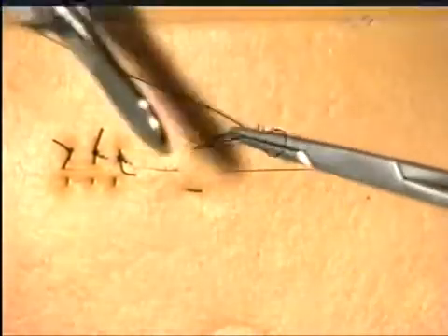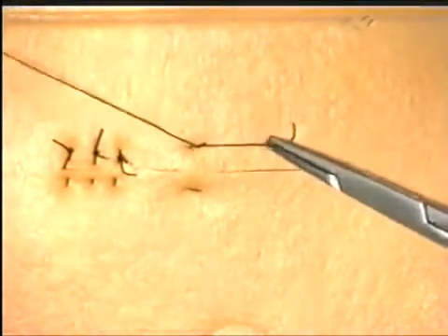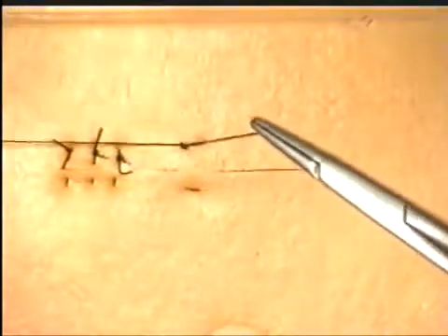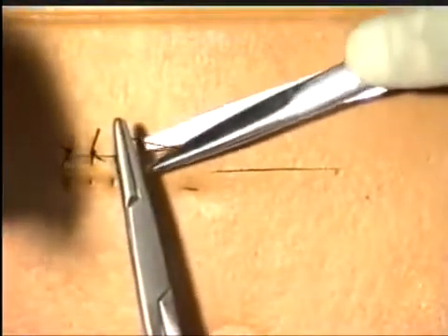One can see very clearly why this is called a horizontal mattress suture. Once again, the reef knot is tied in the standard manner and the suture material cut.